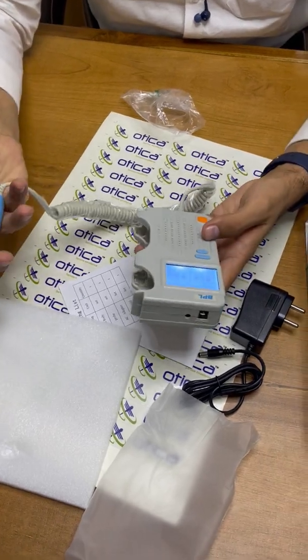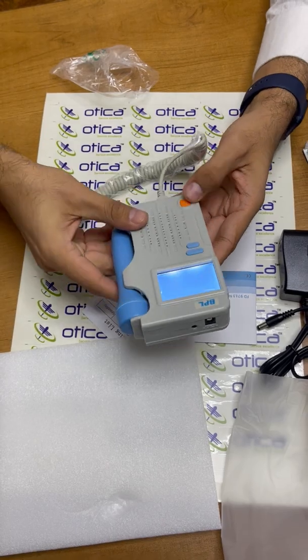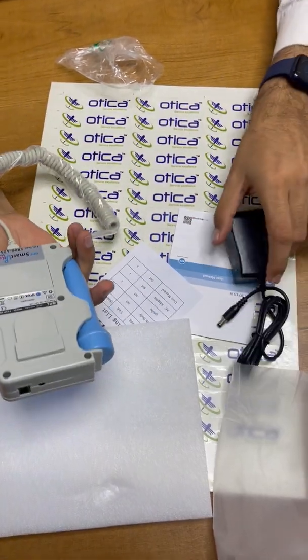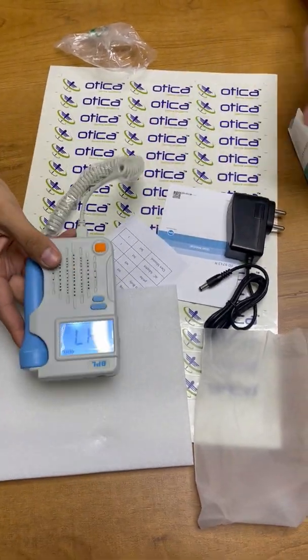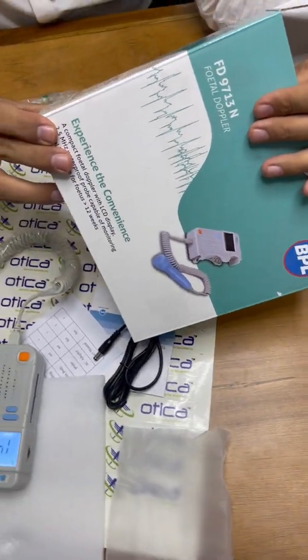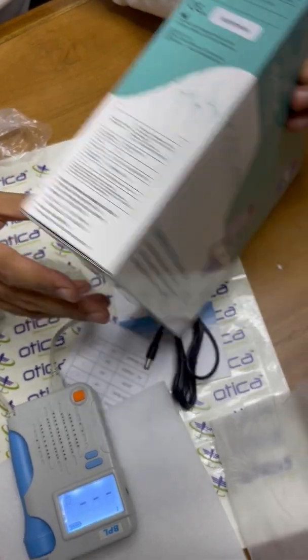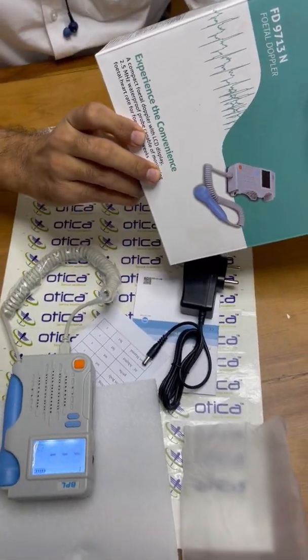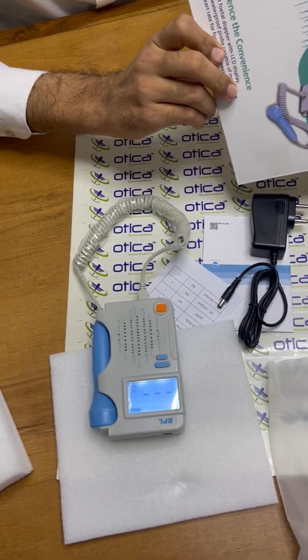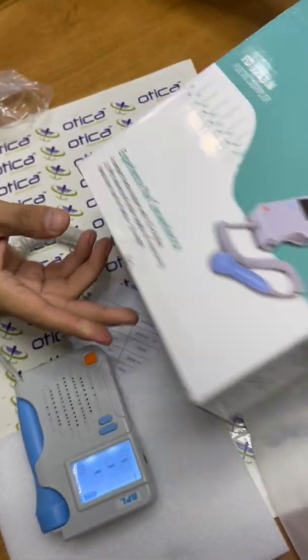Every gynecologist must have this product — it is a very useful product. BPL gives one year warranty on this device. This is a 2.5 megahertz machine and the MRP of the device is seven thousand one hundred and forty rupees. It is manufactured by BPL. Thank you.